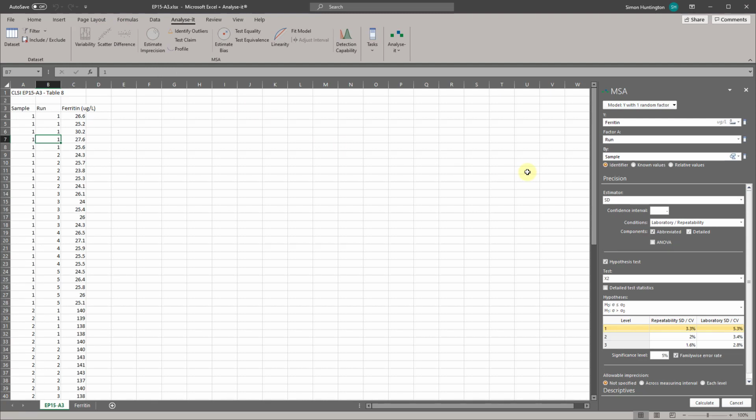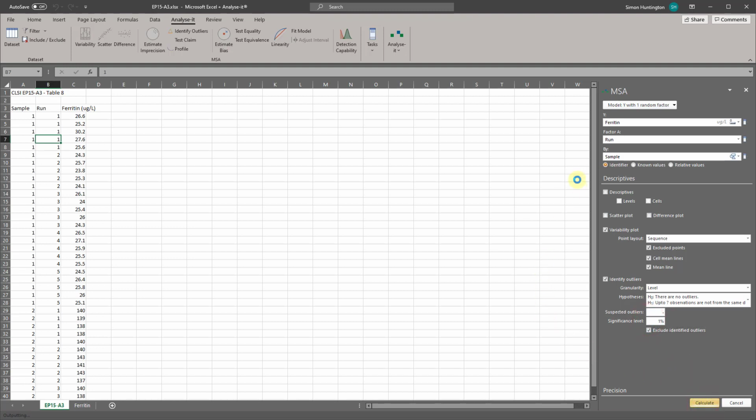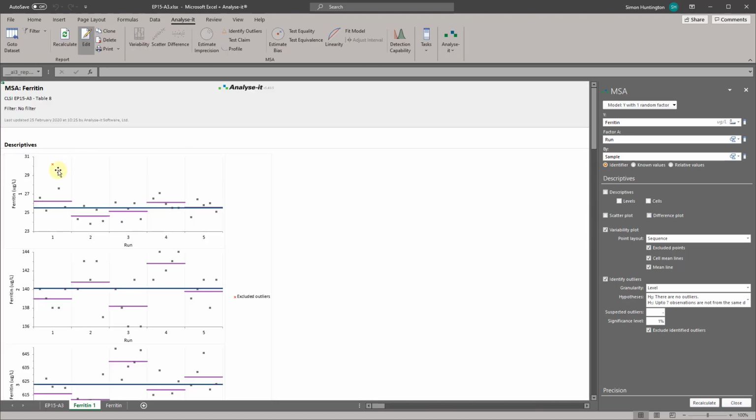With this done, the dataset worksheet activates and the analysis task pane remains open. On the Descriptives panel, select the Exclude Identified Outliers checkbox. Click Calculate, and a new analysis report opens. The variability plot shows the excluded outlier as a red cross.